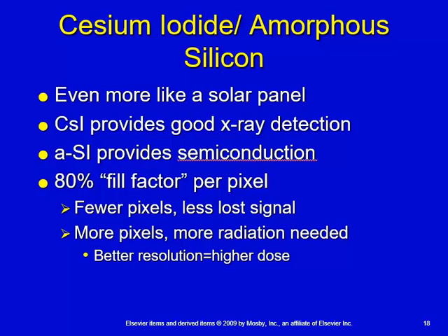So we get better spatial resolution, but lose pixel size or lose sensitivity. So they had to come to some sort of compromise between spatial resolution and patient dose. They could increase spatial resolution, but it would come at the cost of patient dose. Patient dose would go up.